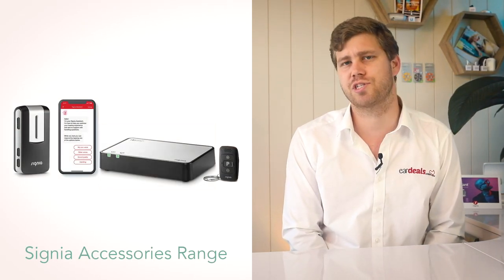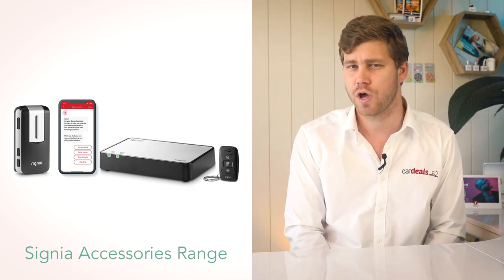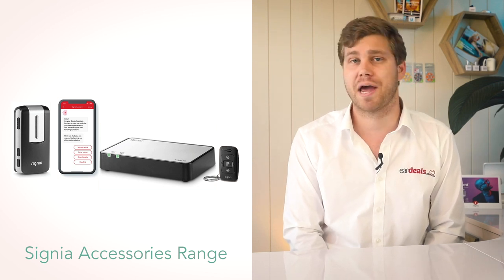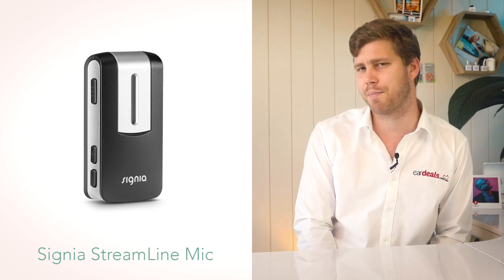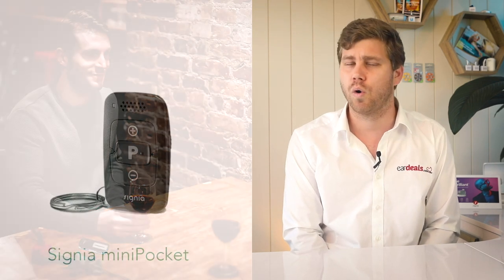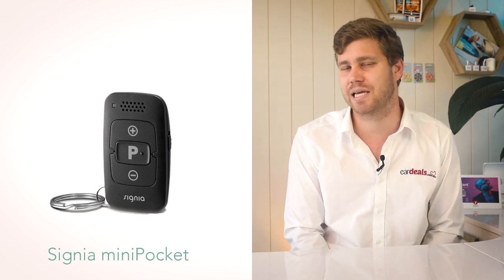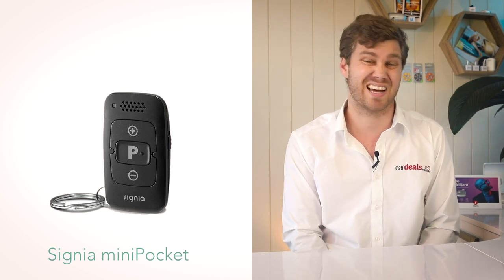Like all hearing aid manufacturers, Signia has a range of accessories designed for situations where the hearing aids might need additional help. These range from additional microphones for clarity in noisy environments — where you might place a microphone on a table in front of a loved one at dinner — to a remote to assist in easily adjusting your hearing aids' volume, a great solution for people with dexterity issues.